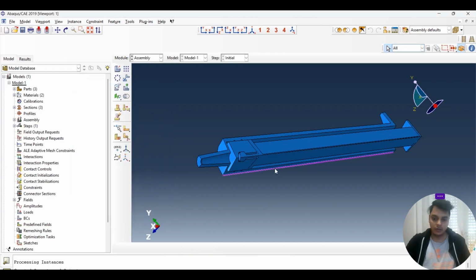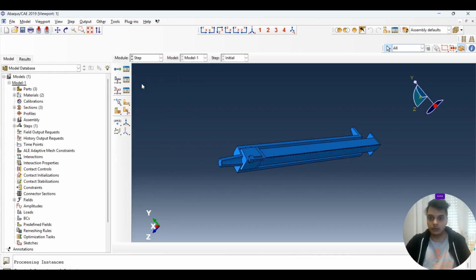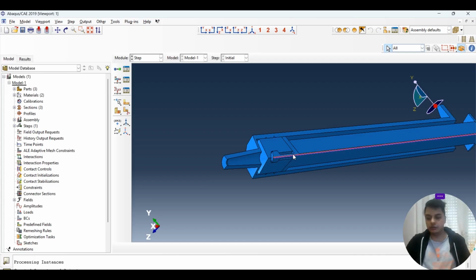For us, it's a dependent mesh again, but we have 3 unique parts, so it doesn't matter to us. Now the important part is to define the step. So what exactly is a step? A step is simply a sequence of series that you want to perform within your analysis. What exactly do we have to do in this part? We have to do 3 things. Whatever interferences we can see right now, the rubber part, we have to tell the initialization to ignore it. That's the frictionless stuff right now.